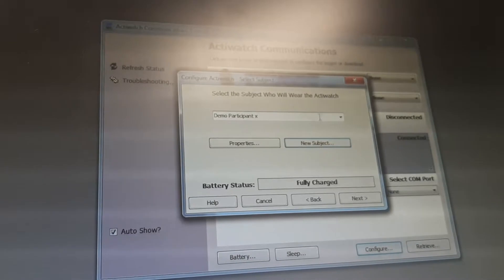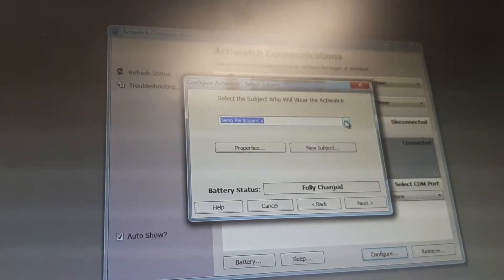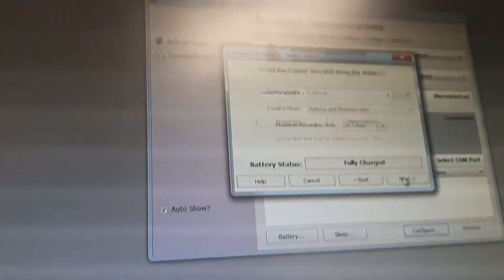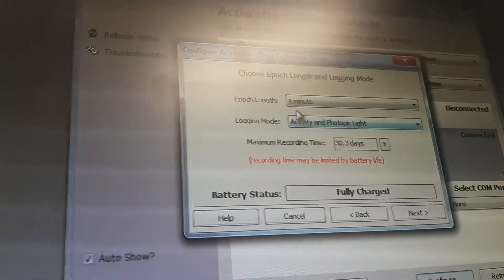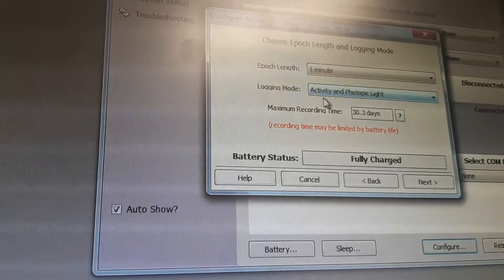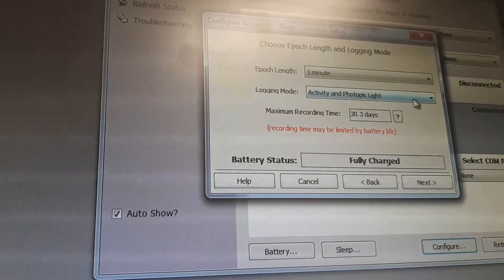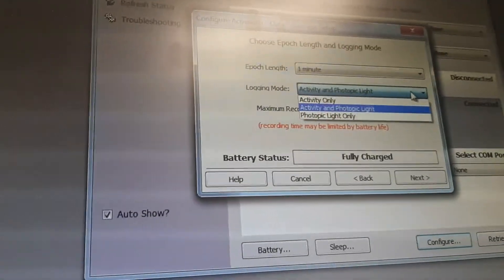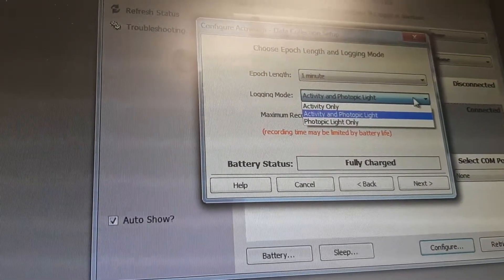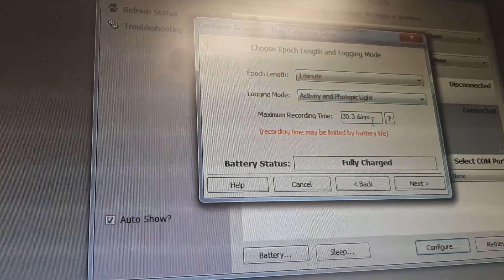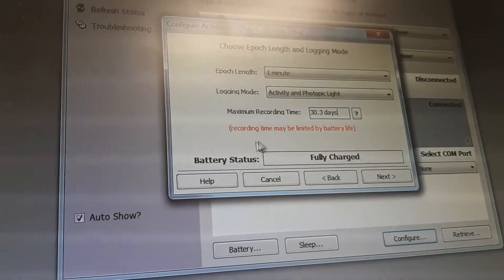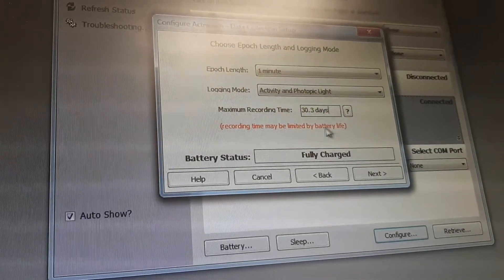So we have Demo Participant X — the battery is fully charged. The epoch time is set to one minute, which is a standard epoch time. The logging mode is set to 'Activity and Photopic Light', which is fine because it records both activity and light continuously. Now I need to set how many days I want to use, which depends on the battery life.